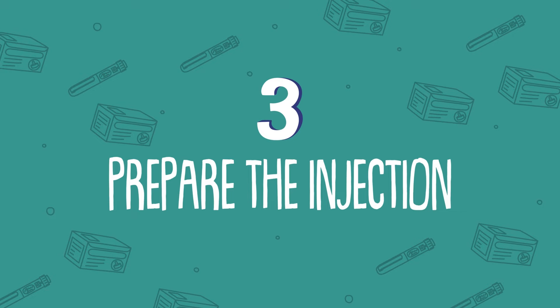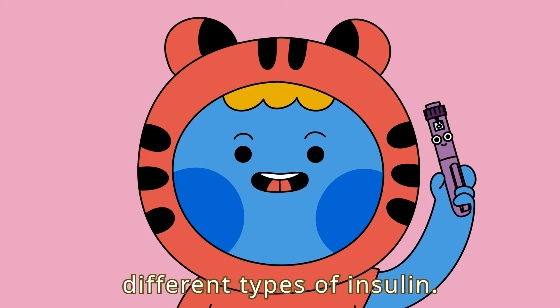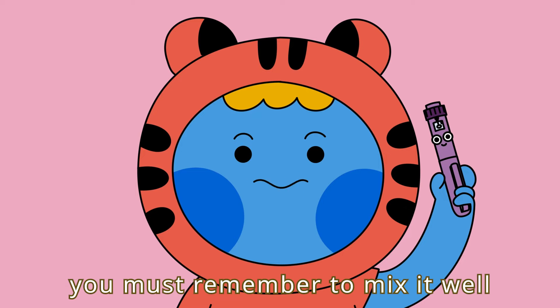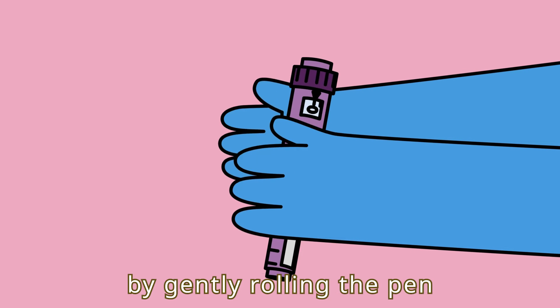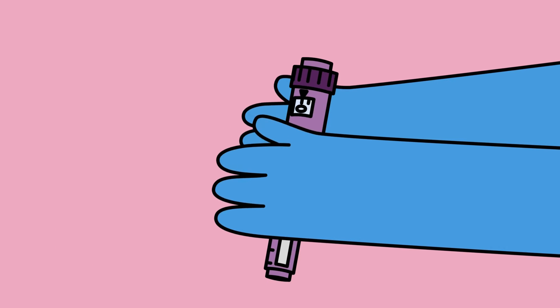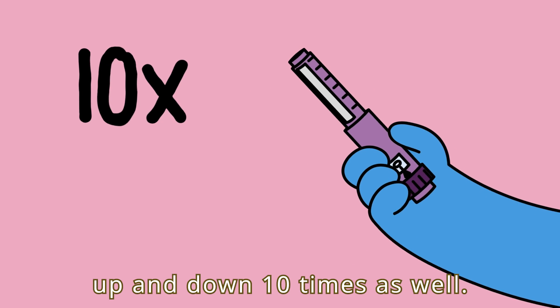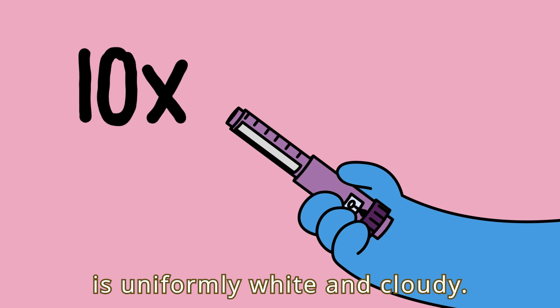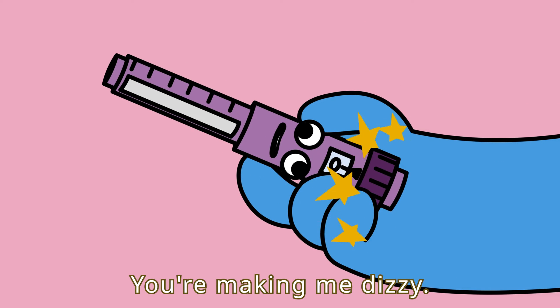Step 3: Prepare the injection. There are a lot of different types of insulin. If you use the cloudy type of insulin like I do, you must remember to mix it well before injection. I mix the insulin by gently rolling the pen back and forth 10 times between my hands. After that, I gently move the pen up and down 10 times as well. This will ensure that the insulin is uniformly white and cloudy. No more, Betty — you're making me dizzy!